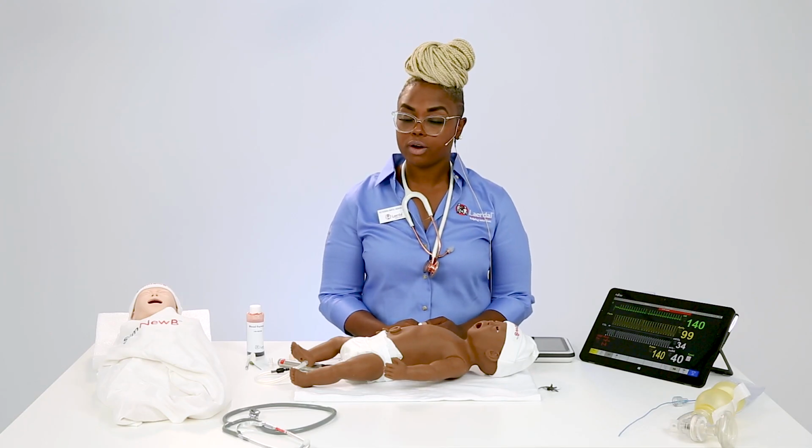All right. Next question, is the Laerdal Scenario Cloud an additional cost or included? I touched base on that a little while ago with the 90-day free trial, but it is an additional cost. Next question I see is, can you use SimNewB with a Neopuff? And the answer is yes. We've actually done some testing globally with it, so yes. What size ET tube does the model take? 3.5 or 3.0.